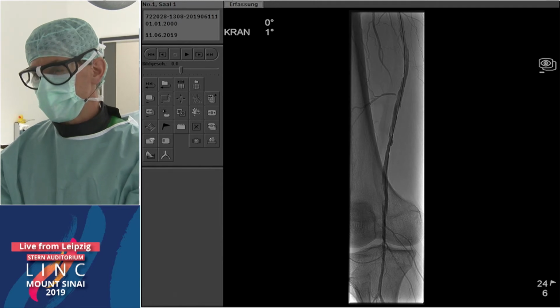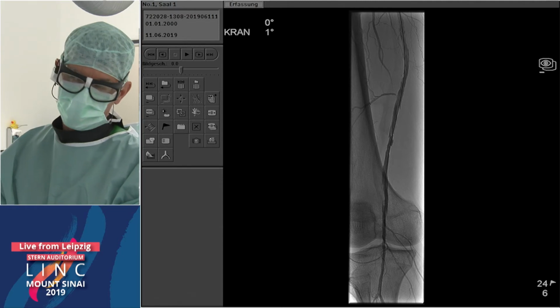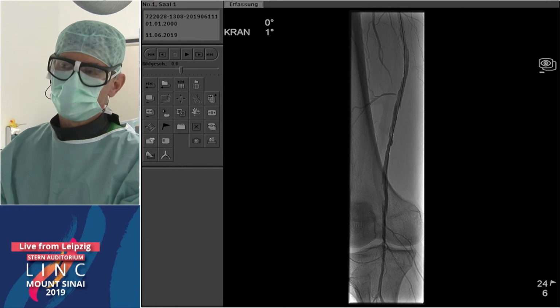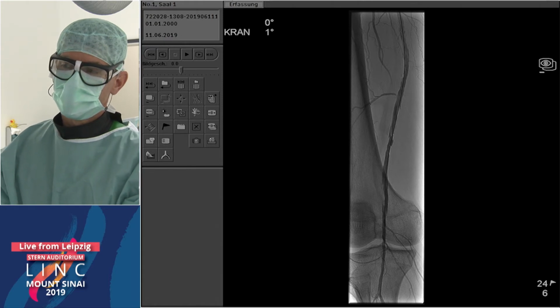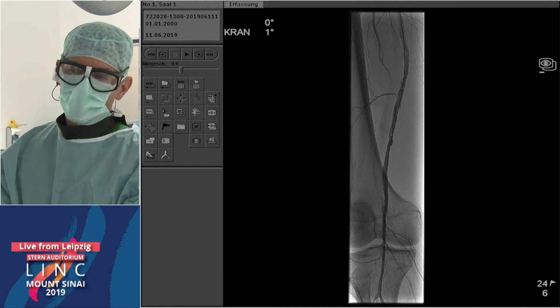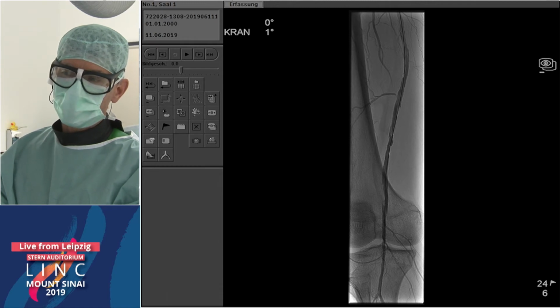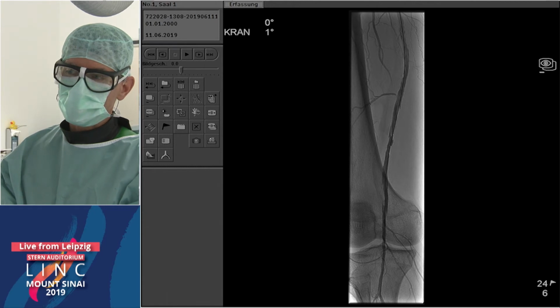Andre, would that be a case, given the small caliber of the arteries, where, for instance, a very focal scaffolding concept with a TAC device would have potential value versus using longer stents? Yes, that could be a solution. Not sure whether a TAC would be a good selection for that calcified plaque very distal, but let's say, for example, for the mid portion, no calcium there, quite some dissection.